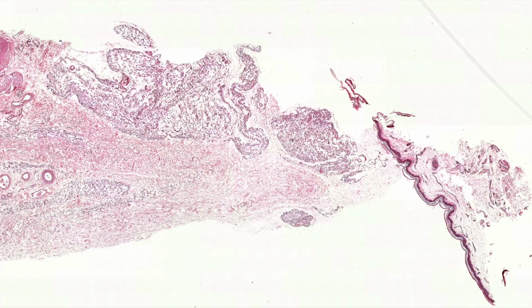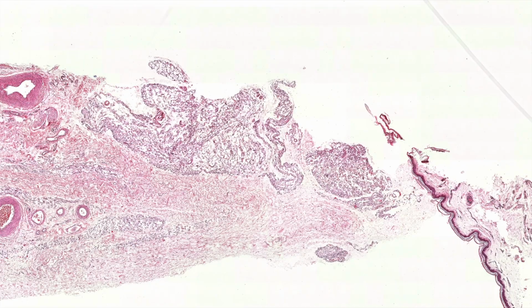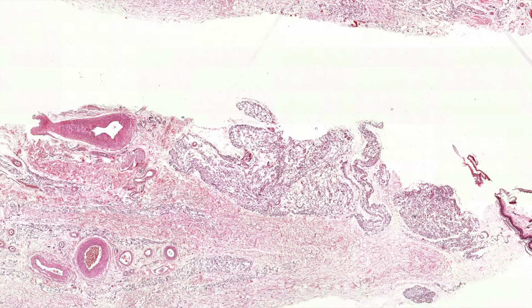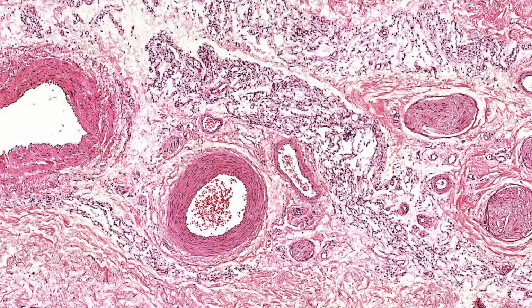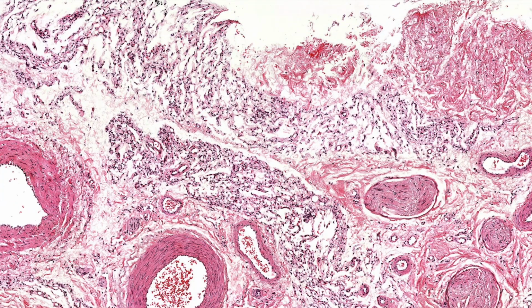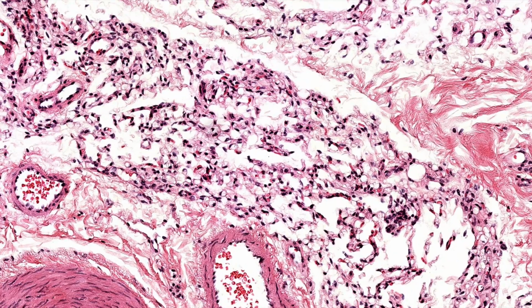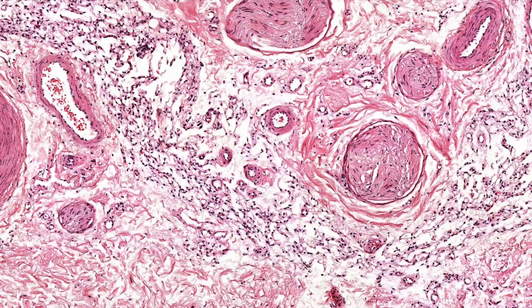I see this pretty commonly in much more subtle, nuanced amounts on a pretty regular basis. To see it like this is uncommon. But I like what you said, that there's fat there. Once you realize it's fat, at first glance you might not realize that this stuff is fat, right? It doesn't look like normal fat at all, and it's way more cellular. But when you go closer, you're like, what are all these little round vacuoles? They look like little tiny baby fat cells.